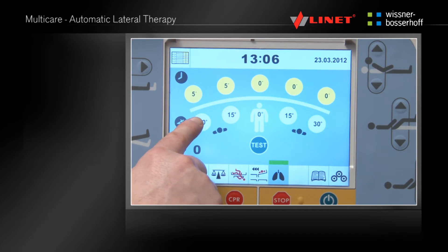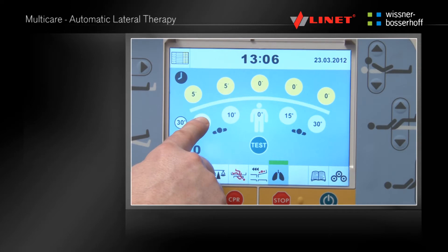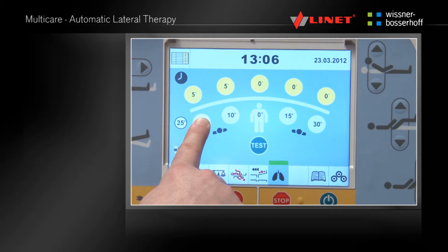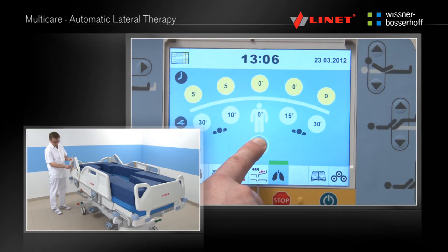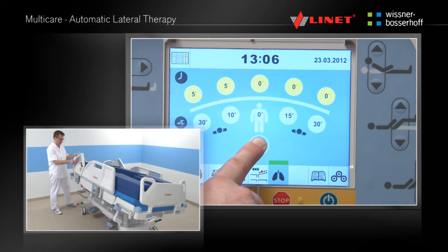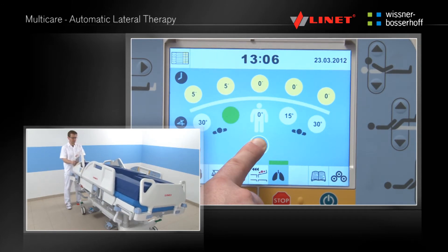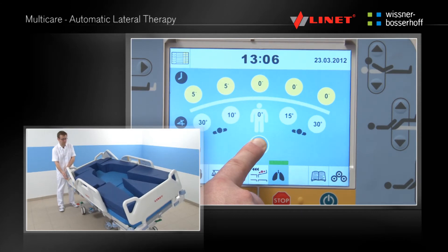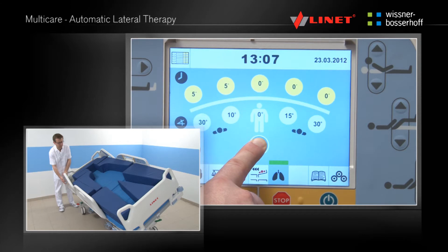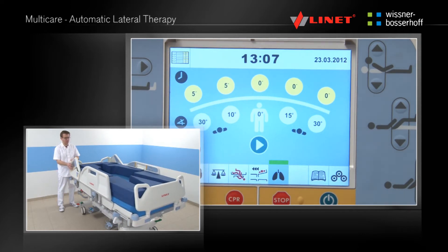The white buttons are for setting the desired angle of the lateral tilt, which can be set up to 30 degrees. After setting is finished a test must be done. The whole cycle is confirmed by holding the test button. At the same time the test will check that there are no collisions with the environment or accessories and that there is no danger for the patient. After confirmation the test button changes to the play button which allows the start of the ALT.